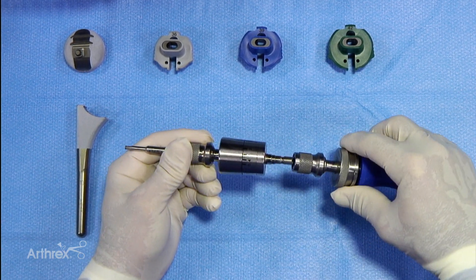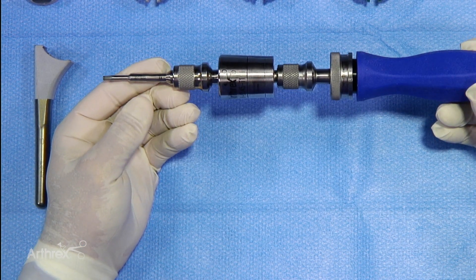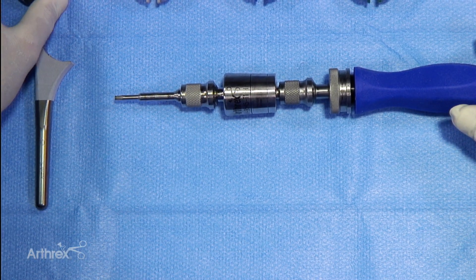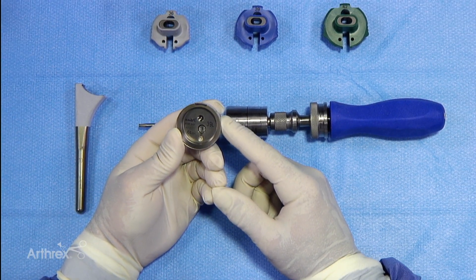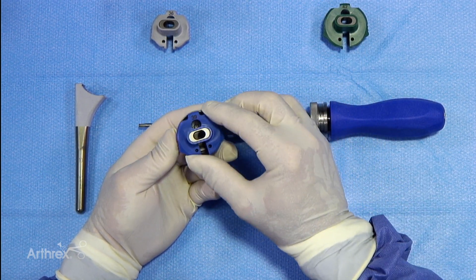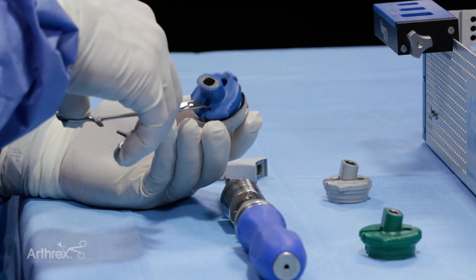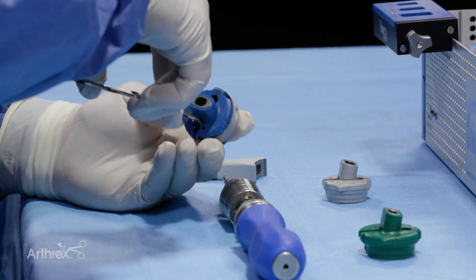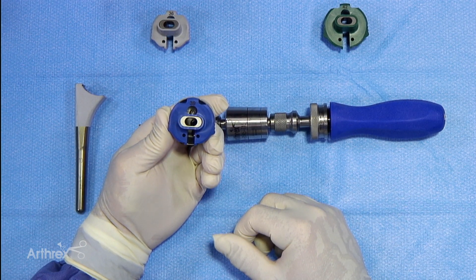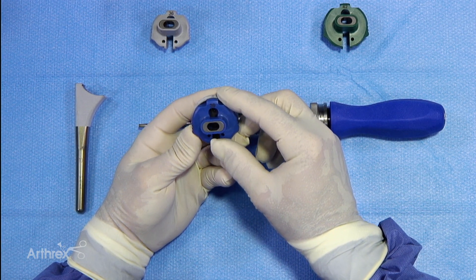We'll put that onto the handle, which will allow it to easily be used by the surgeon, and then we're all set up with our screwdriver. We'll take our cup — this is a 39 cup — so we'll select the 39 guide. You can set this in by hand, but oftentimes it's much easier to take a simple clamp and hold this together. It snaps in very nicely and holds it in place, nice and secure, in the right position. This guide will make sure that our screwdriver goes down in the proper alignment.